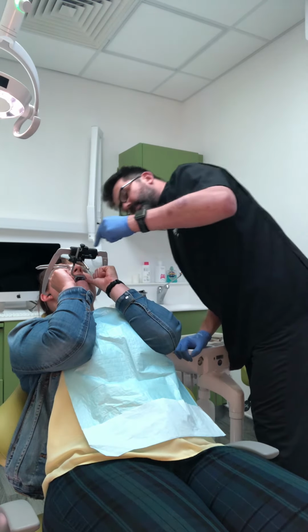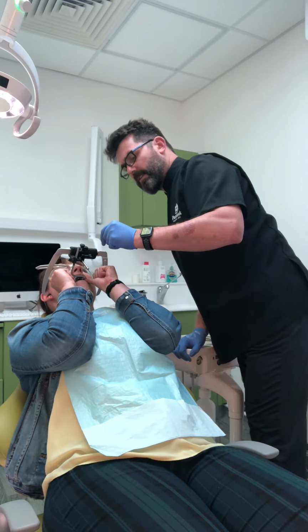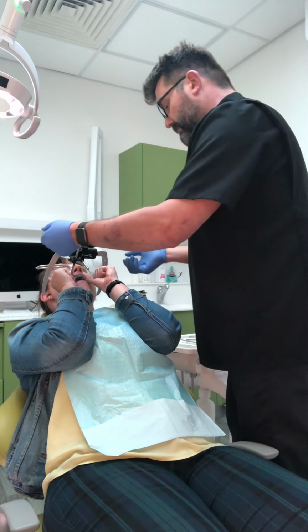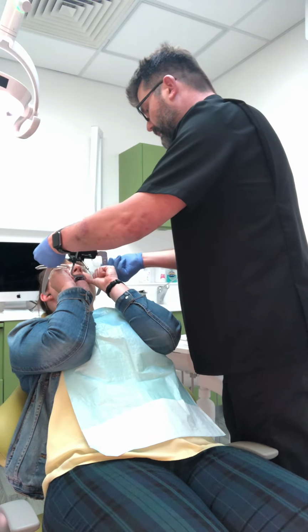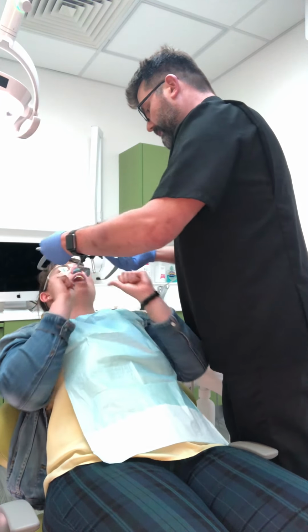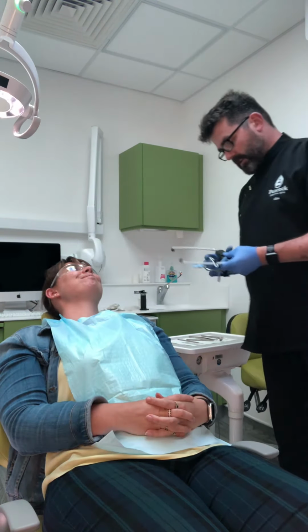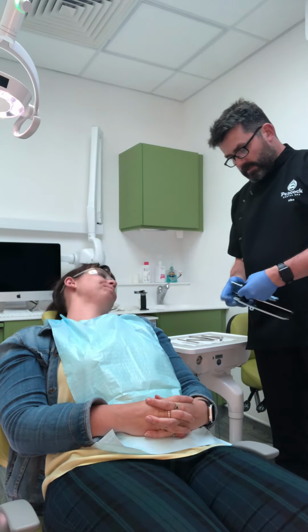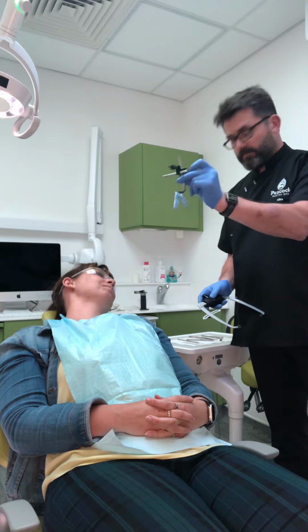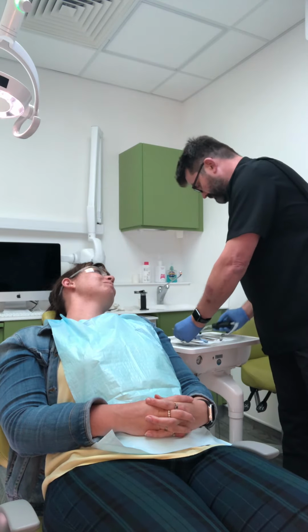Just a quick check to make sure that you're between 110 and 120. Otherwise you might need to go for a fully adjustable articulator, but this is fine for a semi-adjustable. Just going to take that out of your ears, and if you release your grip, please. Perfect. Thanks very much. So all we need to do now is take this bit off, and that's the bit that goes to the lab. Thank you very much. Super.